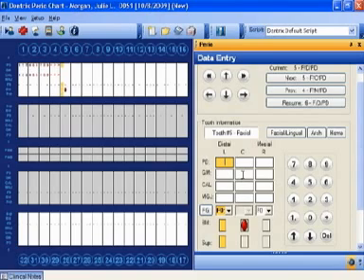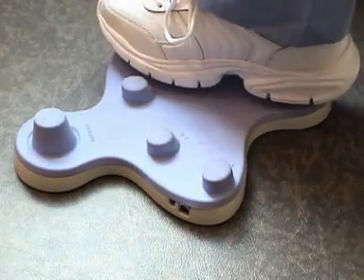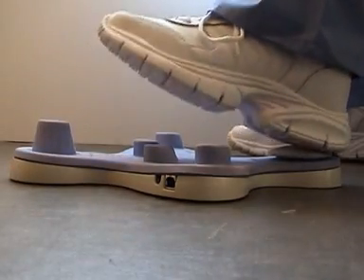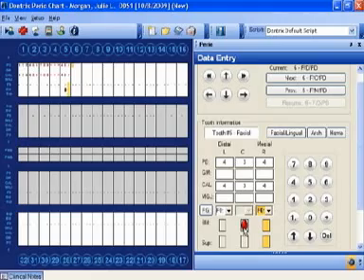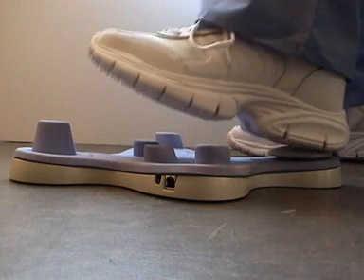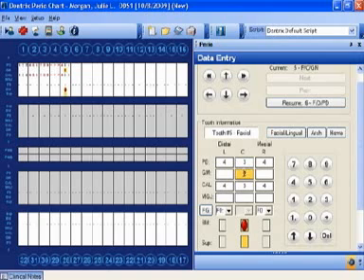So let's say you have a tooth, this next tooth is a 434 with 2 millimeters recession and bleeding. So you'd enter your numbers 4, 3, 4, and then you'd have your mouse on the B. Then you would rock back and heel click, and it's going to mark bleeding. Then I would mouse up to my gingival margin, heel click, and add your 2 millimeters.